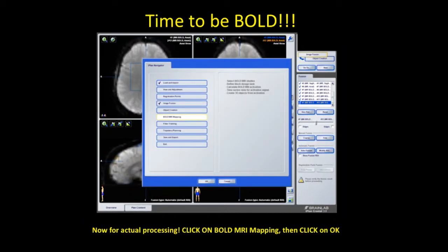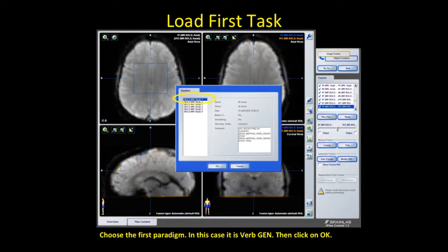For actual processing, click on the bold MRI mapping and then click OK. Choose the first language paradigm — in this case we have verb generation — then hit OK.